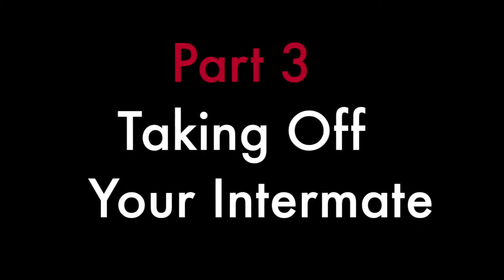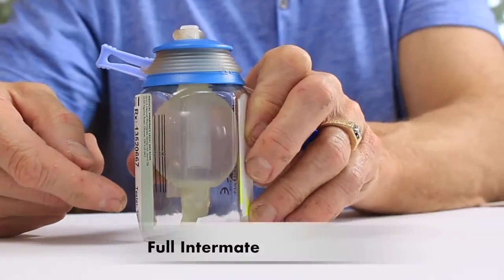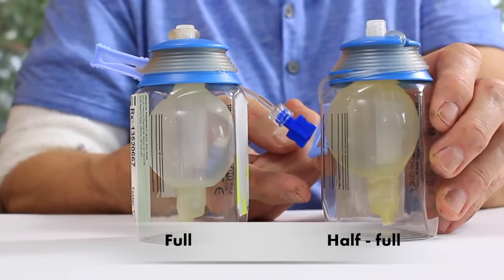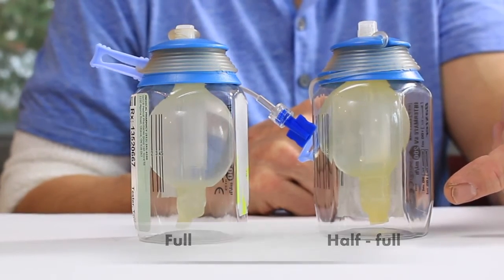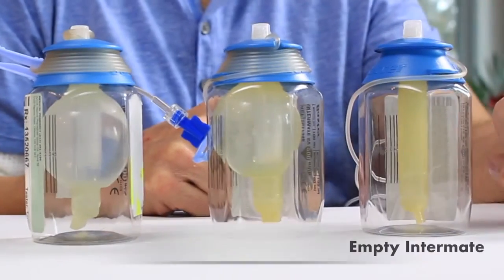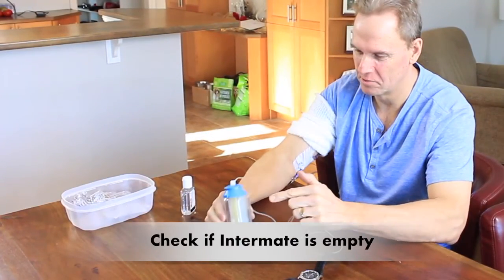Part 3, taking off or unhooking the pump. When you started your medicine, the balloon was full. You can see here that it's half full now because that balloon is getting smaller. And here's what it will look like when your Intermate is empty, when the medicine has all gone through your IV. When the balloon is flat, it's time to take the pump off your IV.